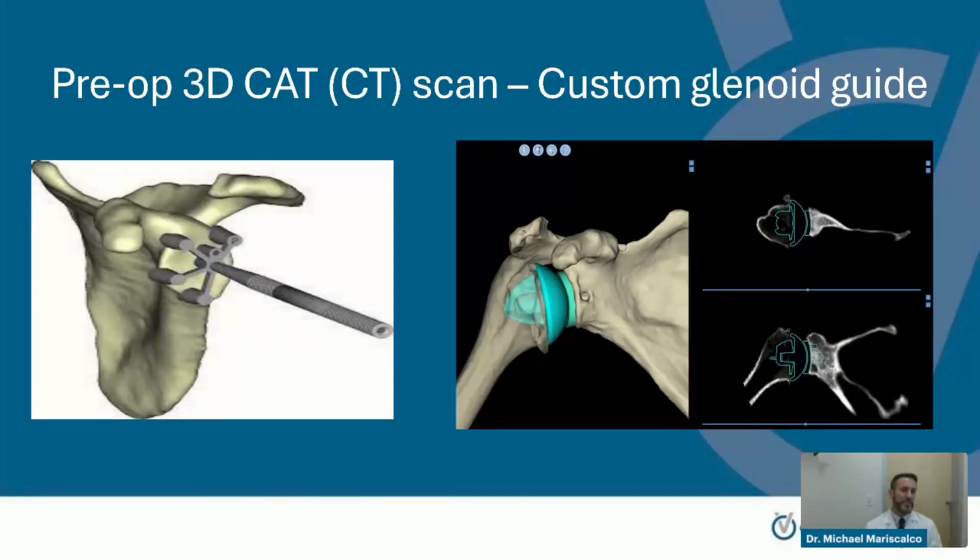It would be analogous to having a preoperative game plan for those sports enthusiasts out there, or simply being able to look at implant position before even entering the operating room. So this has been a very important feature in getting the implant position correct at time zero, which definitely has an impact on overall function postoperatively. And I'll show you a sample if you wouldn't mind flipping over.